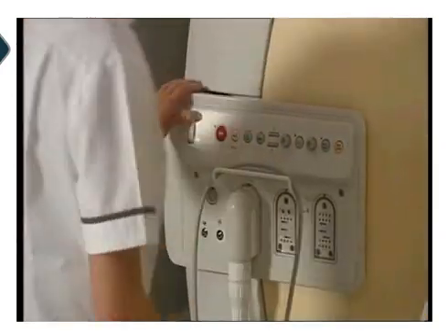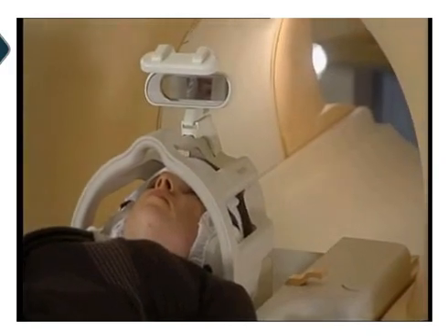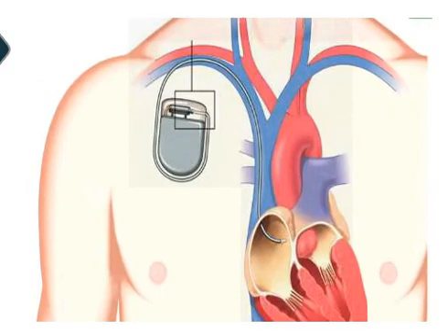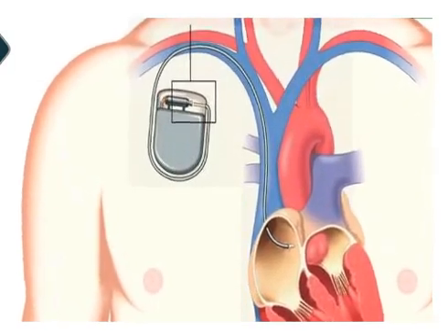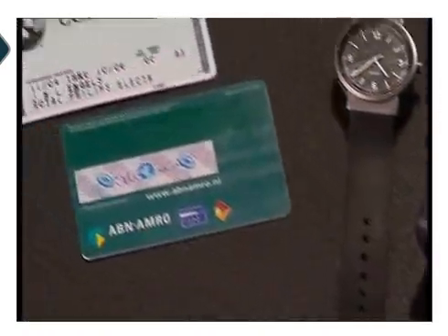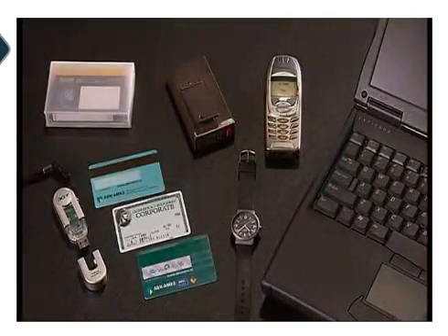Scanning a patient at field strengths above 2 Tesla represents a proportionately higher risk, requiring additional attention to the patient. The magnetic field can also affect the operation of magnetically sensitive active implants, such as pacemakers. And remember that the magnetic field can damage watches and erase magnetic data carriers, including credit cards.